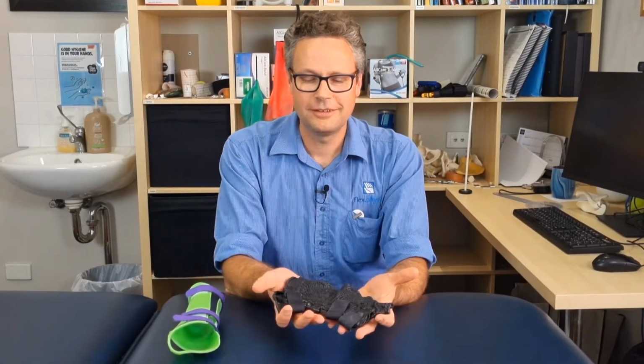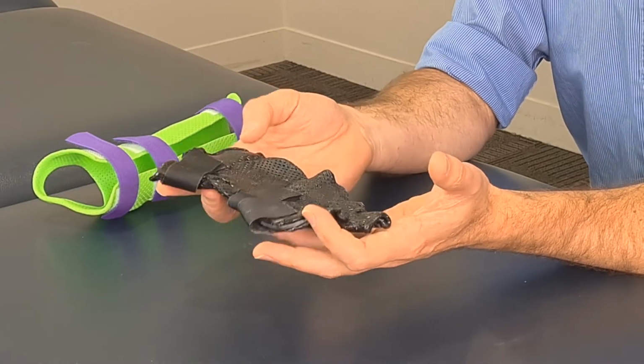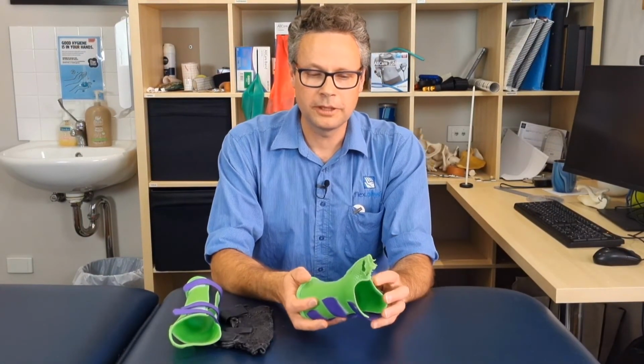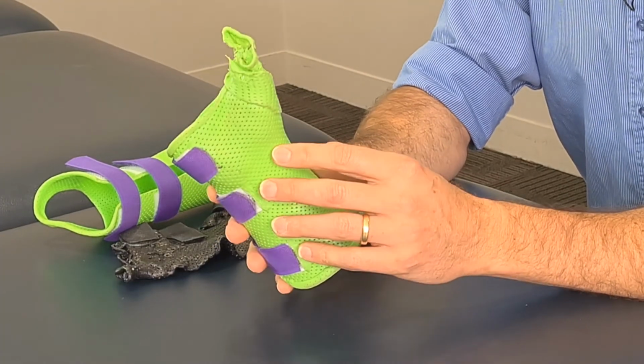Some final words of warning. What not to do with a thermoplastic splint. This is an example of a splint that was taken off and left in a car on a sunny day, and within about 15 minutes, it had turned into a bit of a pancake. Intense heats melt splints, but it's not going to happen while you're wearing it. And this is a splint that a patient took off and left where their dog could get to it, and as you can see, it made a fantastic chew toy.